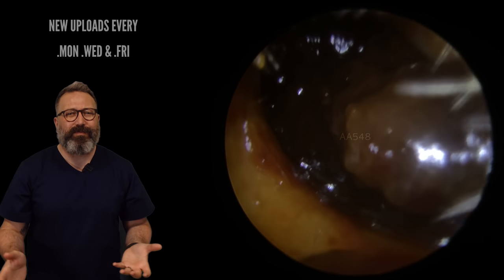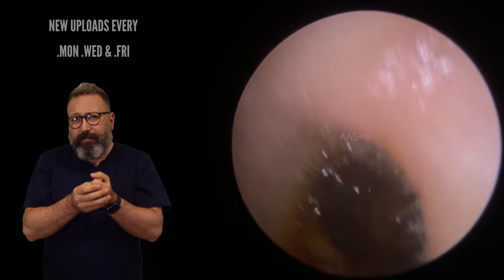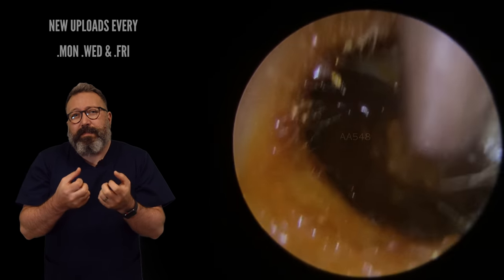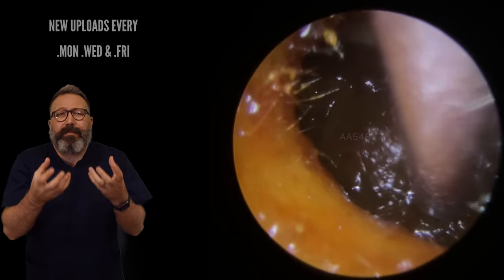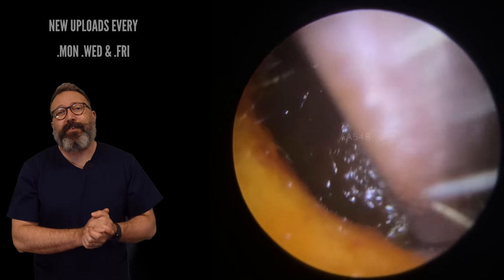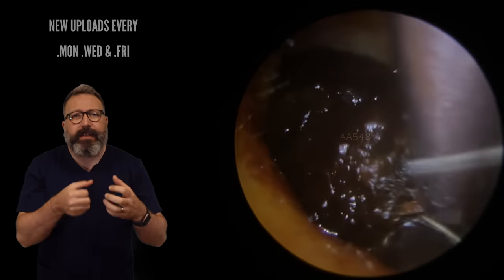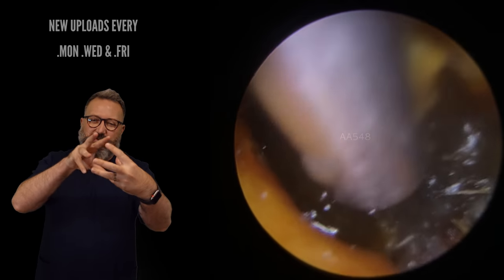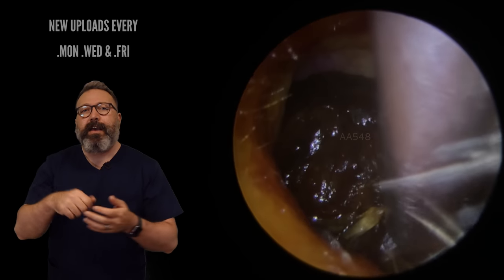Okay, so we've gone from one extreme to the other here. Now this wax — my heart does sink a little bit for wax like this. It's not so much challenging, but it's just fiddly more than anything else. When you get this really squishy, soft wax, the patient — bless them — has been throwing olive oil in by the gallon. There was so much in here that the wax has now turned from something with a little bit of structure to something completely squishy, wet, and sticky, and it's got everywhere it shouldn't be. So not an easy one to remove. What you tend to find when you're using suction on this is that as soon as the suction tube comes into contact with it, you can see all the bits getting sucked in, but it tends to block really quickly. There's a lot of — you try, you start to get the wax moving a little bit, and then all of a sudden it just stretches and detaches at the front section. So you're constantly having to pull the tube out, flush it through, go back in, take the next bit, flush it through again. It's quite painstaking, this one.